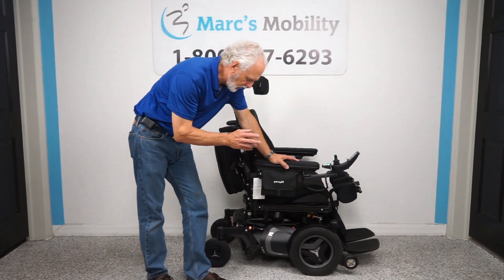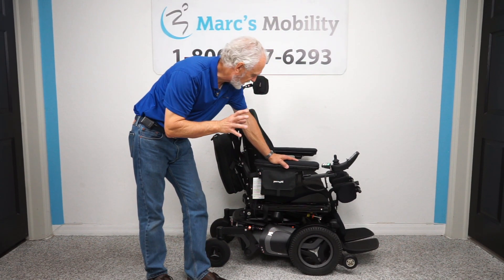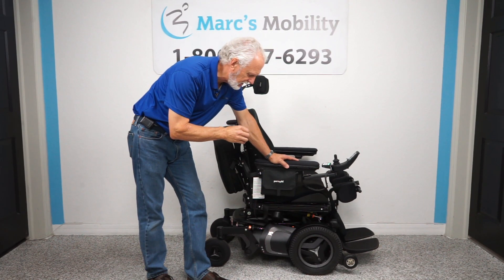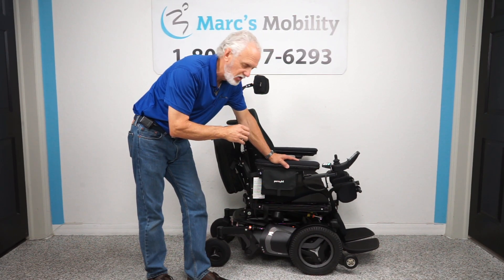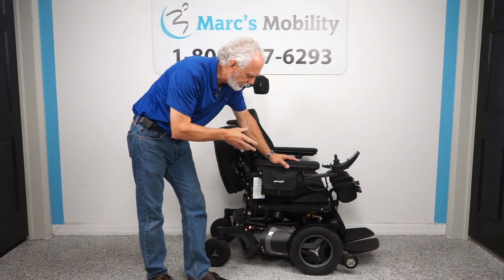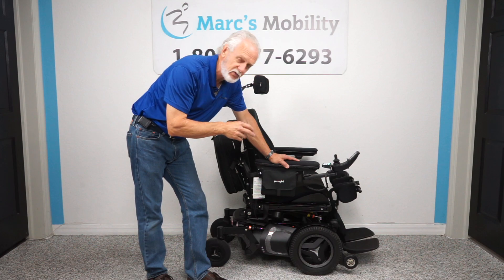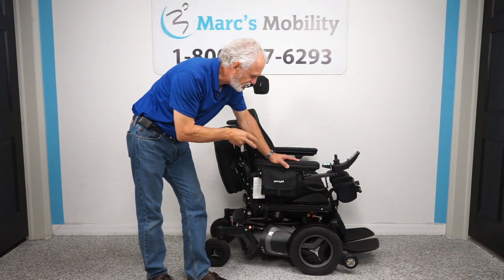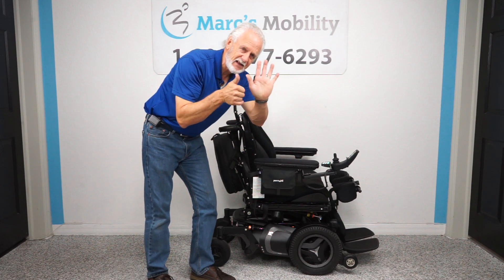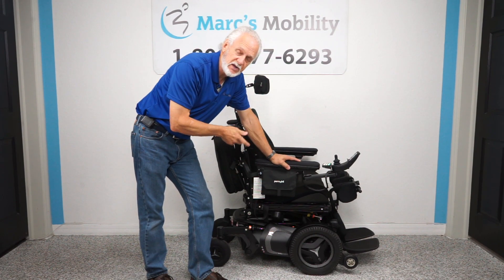This is a one-of-a-kind power chair with a lot to explain. This is a top-of-the-line power chair — the Permobil F5, probably the most expensive and highest quality power chair they make. This chair has only 36 miles on it, meaning it was used less than two months. It has six electrical functions and high-speed motors.